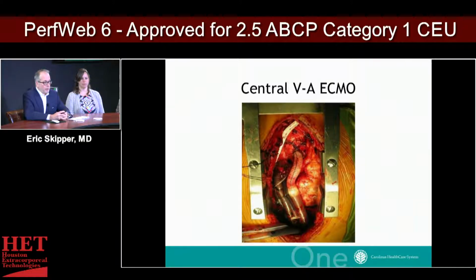I personally prefer to use a 19 femoral type cannula placed in either the aorta directly or in a graft. And I will oftentimes use a 25 multi-stage femoral cannula just to have more cannula to tunnel, positioning the holes in the right atrium as well as the IVC.